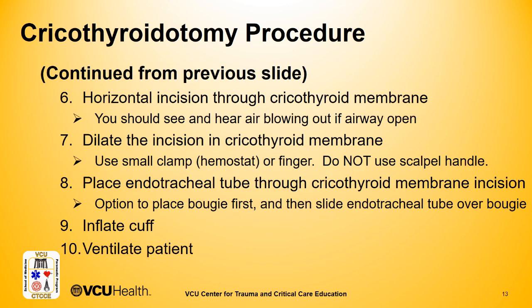Once you get down to the airway, because you were making cuts and feeling and checking your anatomy as you go down and constantly palpating, making your cut with the right hand, removing the knife, using your left hand to feel in the hole and then going back in with the knife, back and forth, never having the knife and your finger in the hole at the same time.